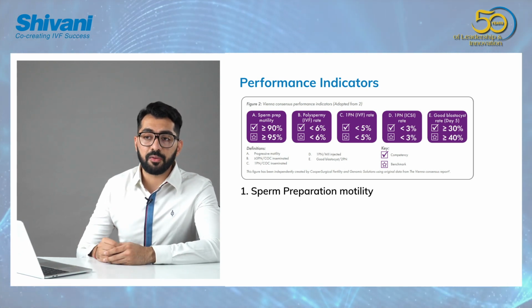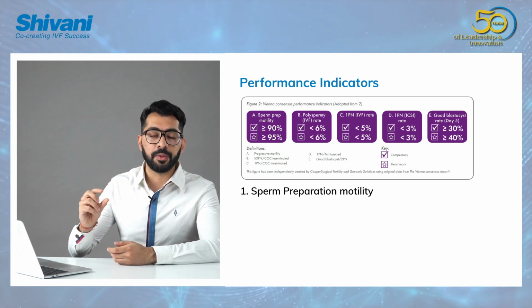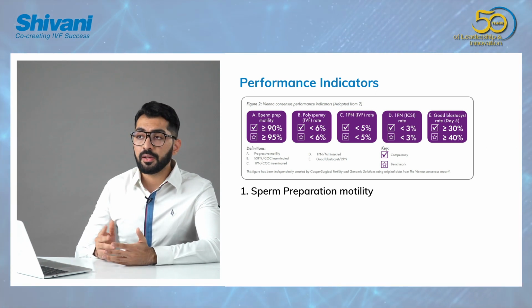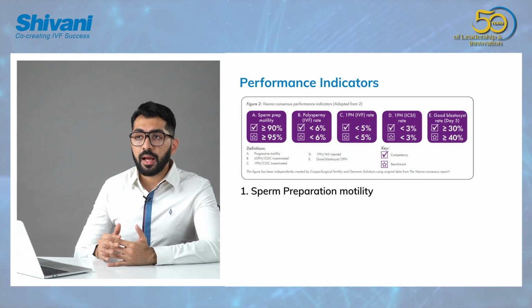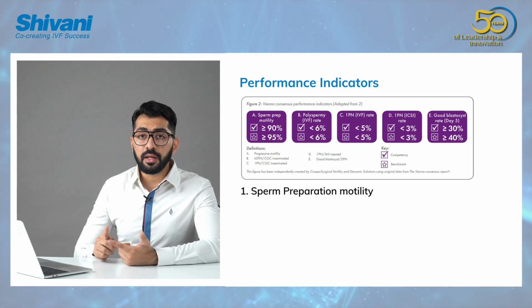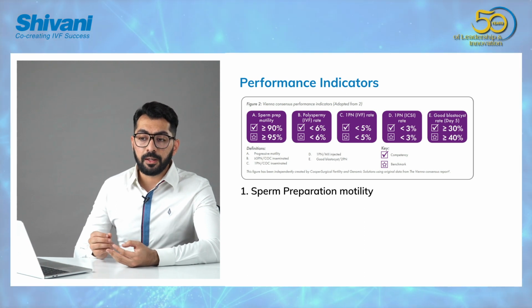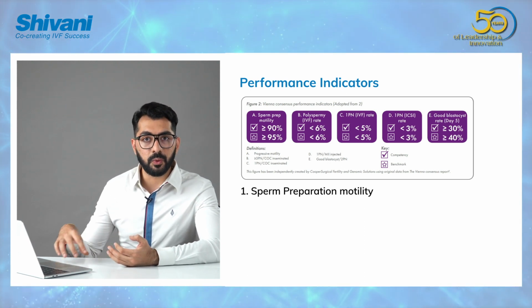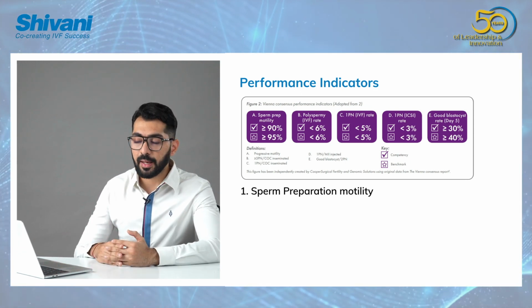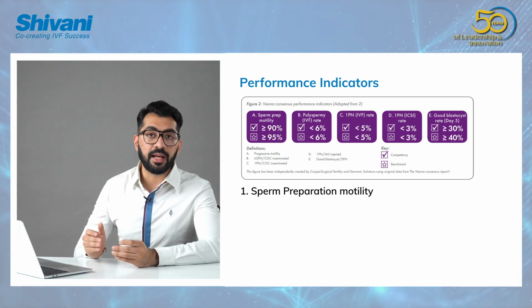A small example of this could be that when you're taking out the final pellet, you've left out some of the residue, and that has contributed to increasing the number of dead sperm within that pellet. And it's also sometimes telling me about the skill of the androtechnicians. It can also tell me about the quality of samples that I'm getting in the laboratory. It can tell me, let's say, if I'm exposing the sample for too long before sperm preparation, or even after sperm preparation, during the time that I tabulate this. All of these things can also influence the percentage motility after sperm preparation.